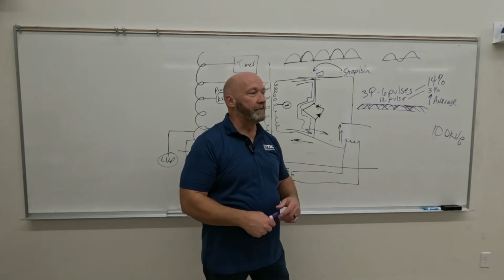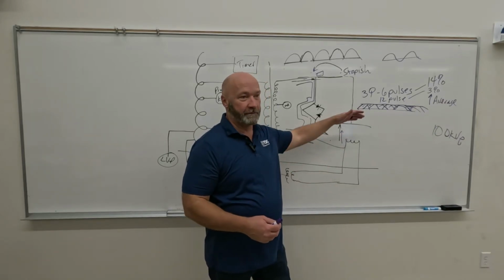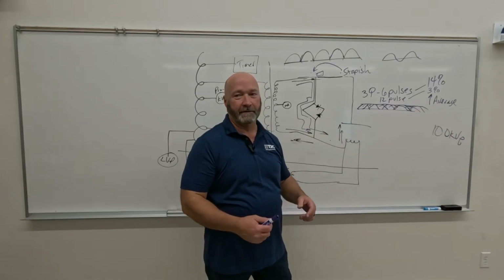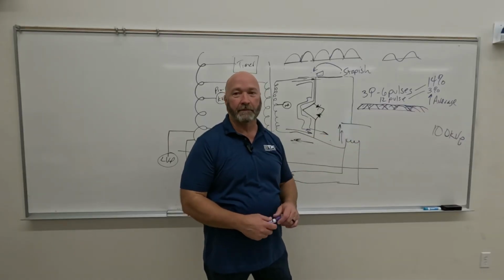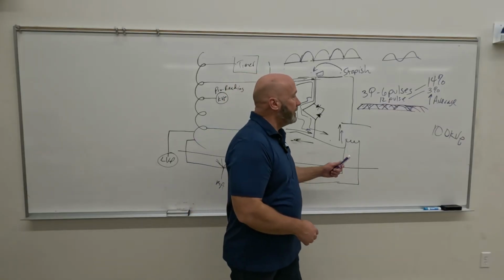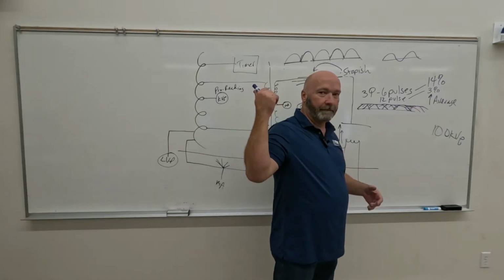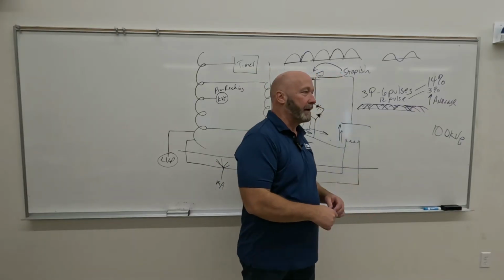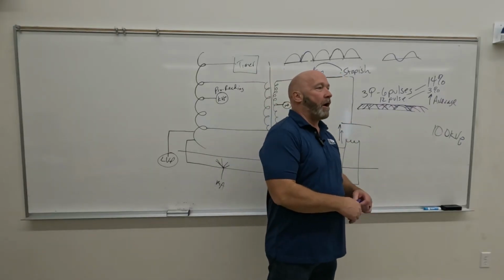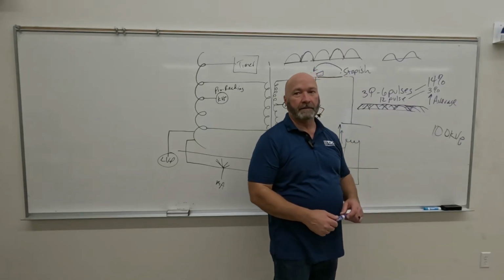They've insulated those to the point that you don't hear it nearly as much as what you used to, but when they first started coming out with those, it sounded like something bad was happening in an x-ray room. It was very audible. So that's high frequency. Okay, so our brand new machine up in the lab is high frequency. Probably every machine that you're working with is high frequency.